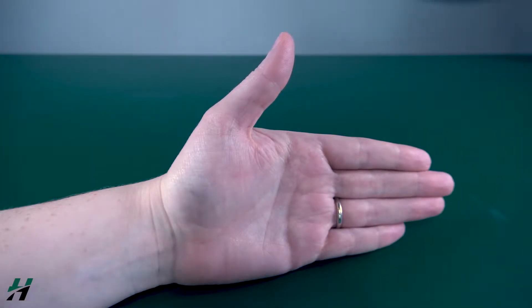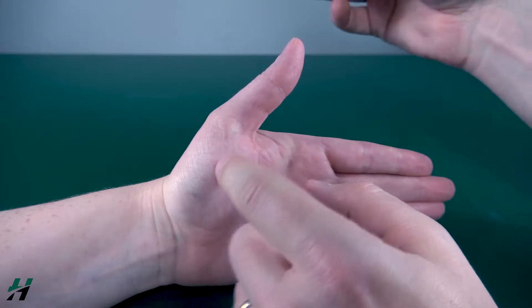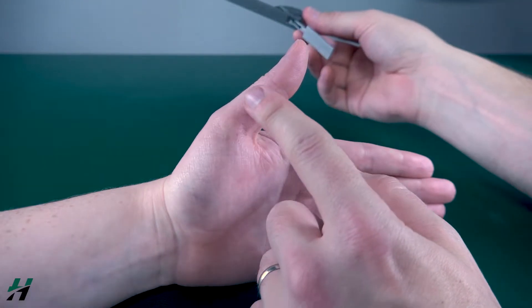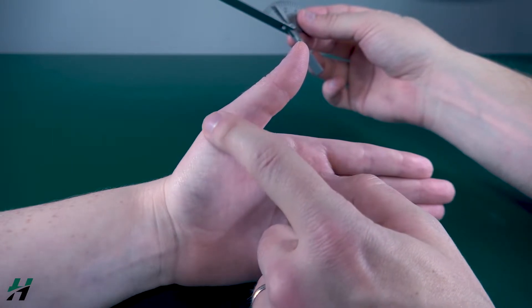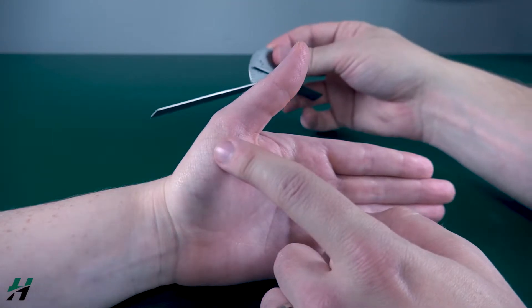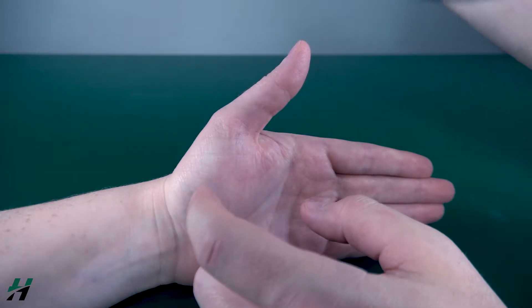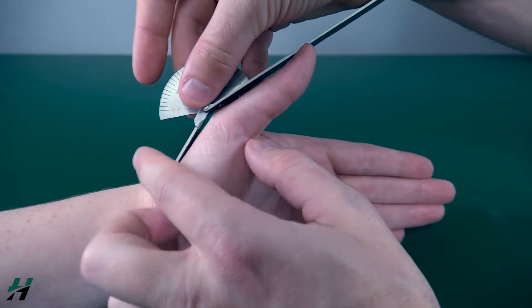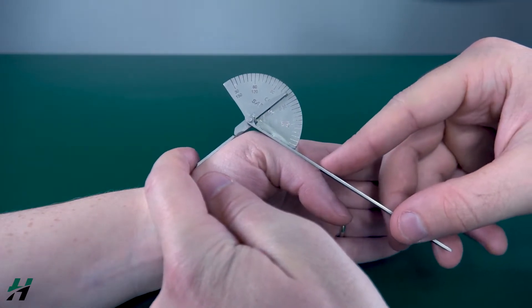Measuring thumb MP flexion. Your axis of your goniometer will be on the first MP joint. Your movement arm will be on the proximal phalanx and your stationary arm will run along the shaft of the first metacarpal. Rachel, if you could flex down your thumb for me.